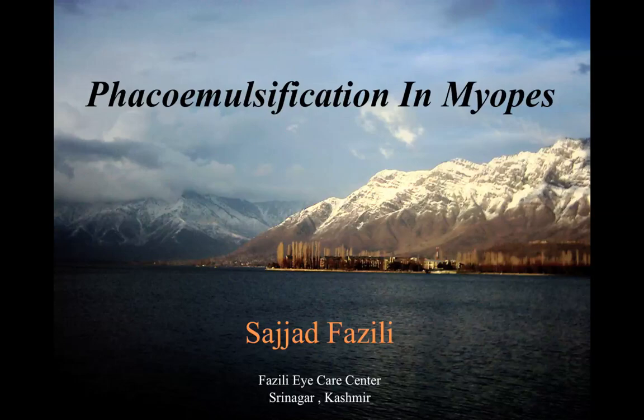Highly myopic patients with preoperative refractions of -10 or more are often the happiest because a lifetime of nearsightedness is finally cured with the successful surgery. However, these myopic eyes pose challenges and additional risks during the surgery and in the perioperative period.